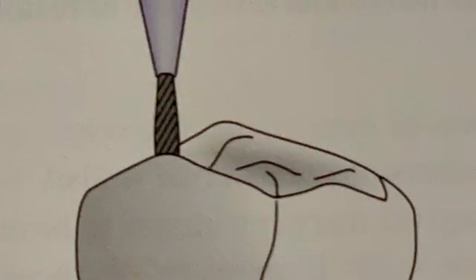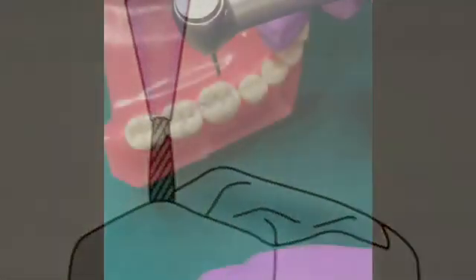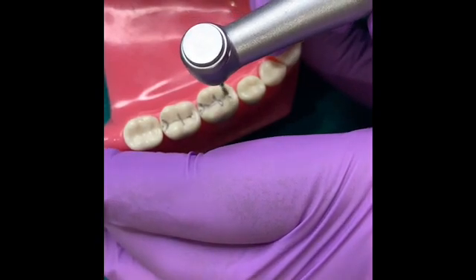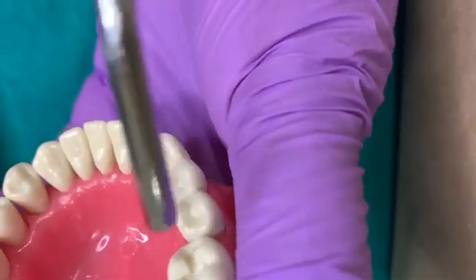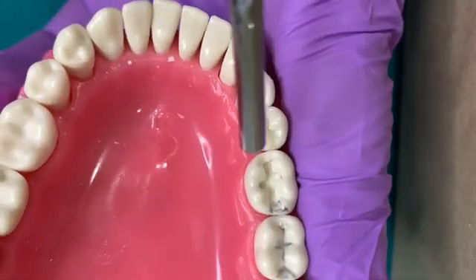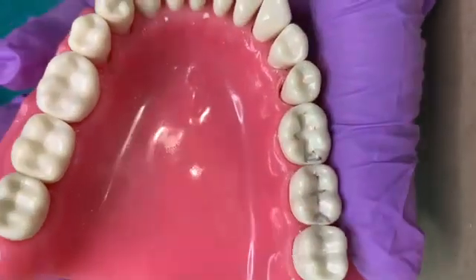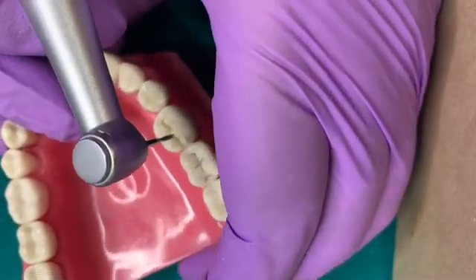First, a class 1 cavity is cut on the occlusal surface. I am going to begin from the mesial pit. Let me just clear the cavity — I can have a clearer view of it now. We will then convert our class 1 cavity into class 2.